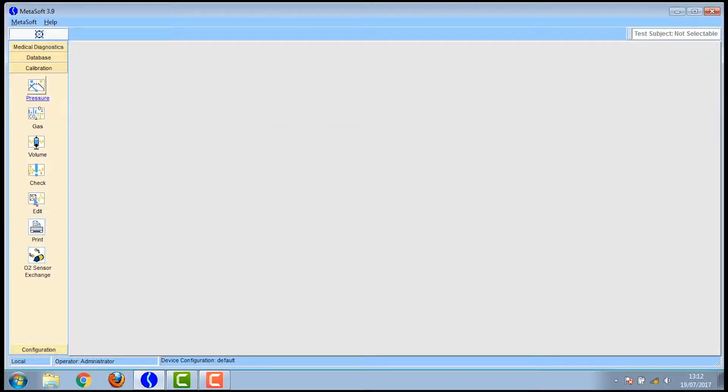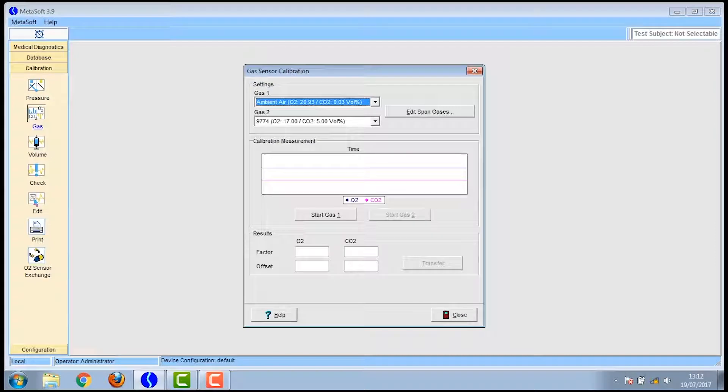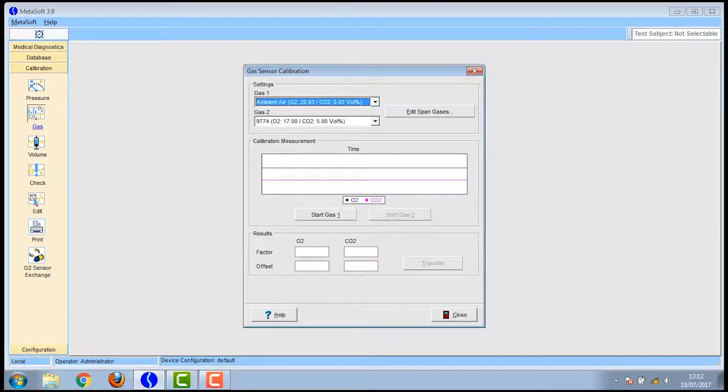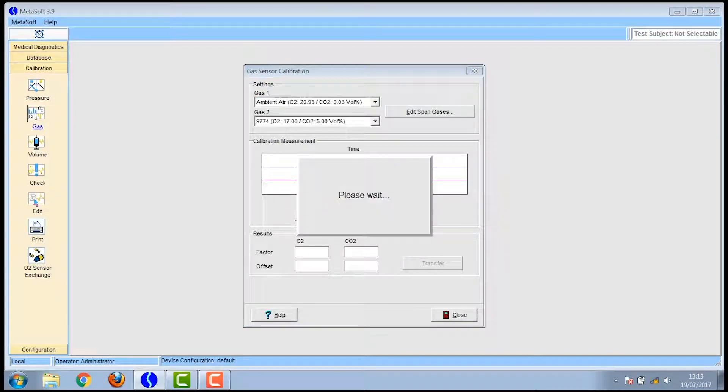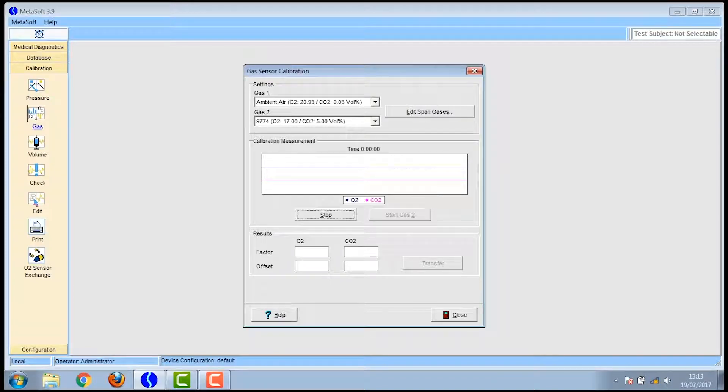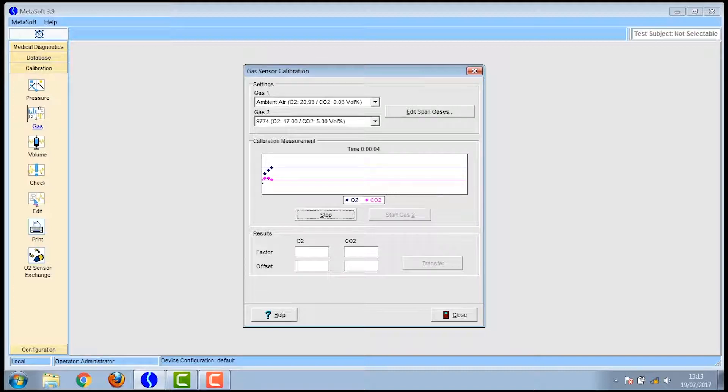You can then click on the gas on the left hand menu and you need to ensure the sample line is not plugged into the flow sensor. First you'll be measuring the concentration of ambient air and so you press start gas 1. You will see there are two lines going across the screen. One is for oxygen and the other is for carbon dioxide.